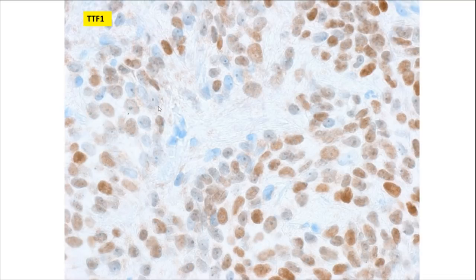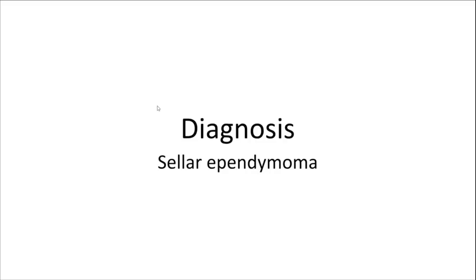And this is the TTF1. So this tumor expressed TTF1, with EMA dot-like positivity. So this is actually a sellar ependymoma.